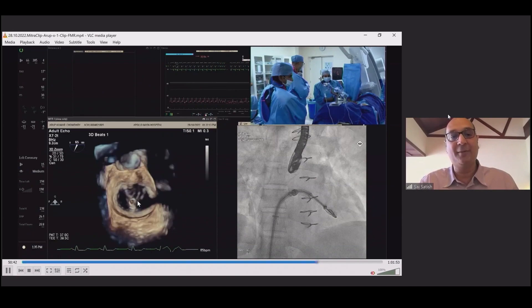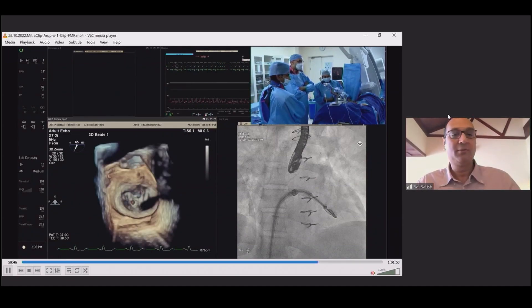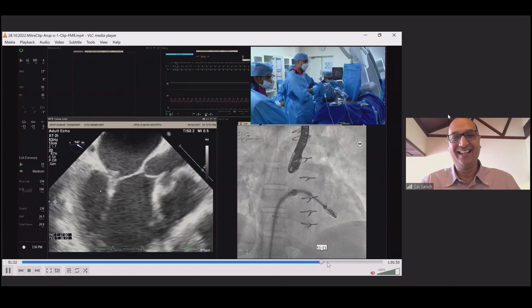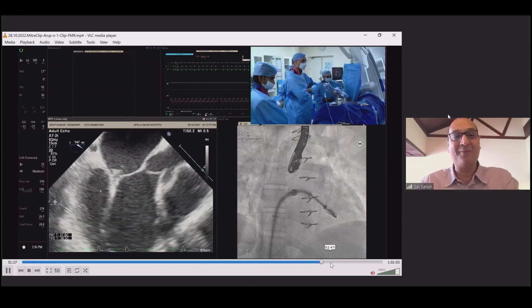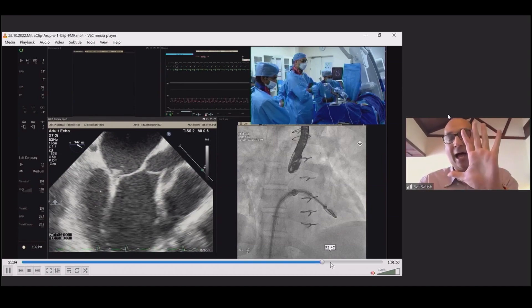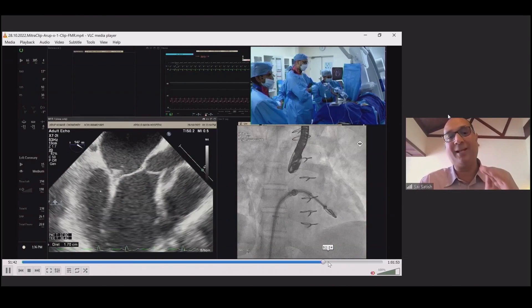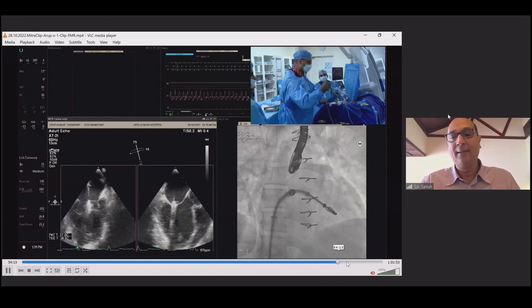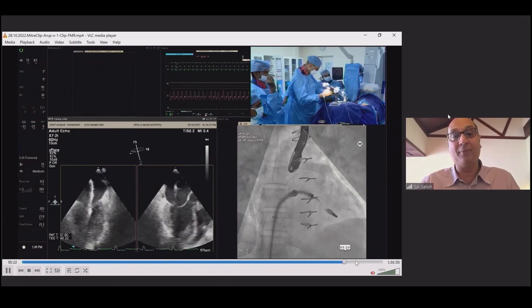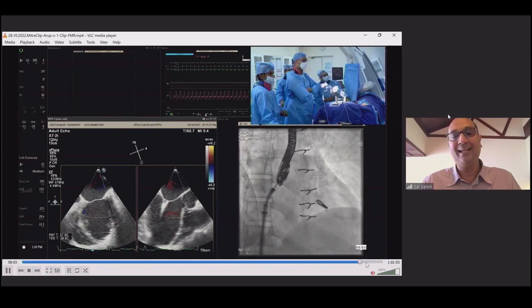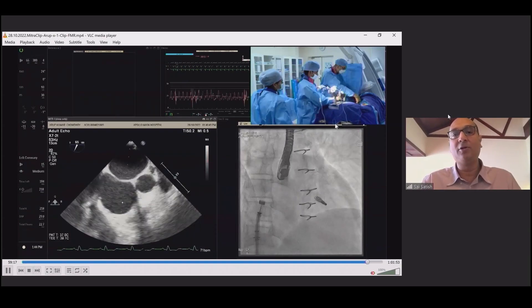You can see a nice tissue bridge here. What transmitral gradients do you accept? Up to 5 mmHg. Ideally what I like to see are twos and threes — that's when they really blossom. So no MR — I let the clip go. Once I've finished: pulmonary vein flows back to normal, you can see no leak at all. When I let the clip go I have my echocardiologist show me LVOT and bicommissural so I know where my spear is. I take everything out, single Perclose.